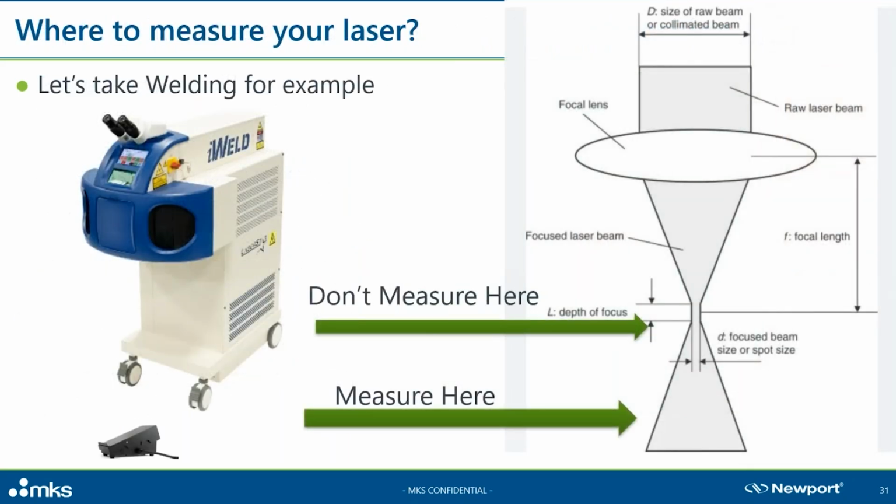Let's look at a real example. A medical instrumentation company called me up. They have a new laser welding station and they were worried because they had already burned their small 30-watt sensor. I had to go in person to explain to them why the waist of the laser is not a good place to measure your laser.